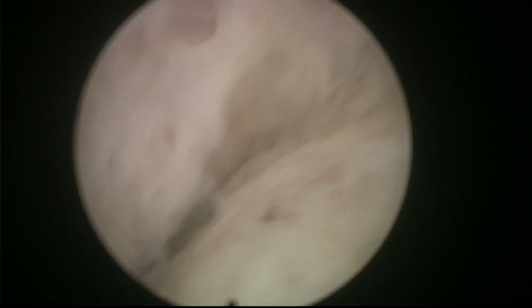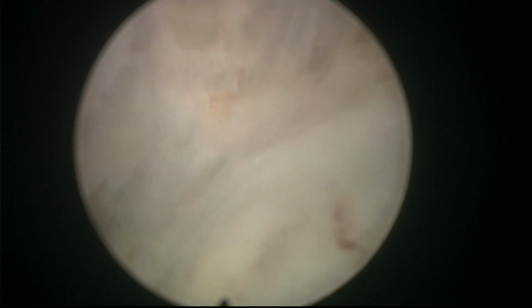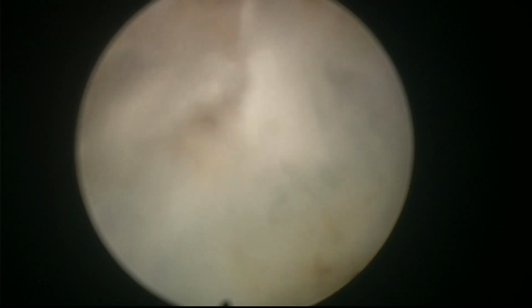But he was telling me, I managed to do a very, very large gland in an obese patient without having to do a perineal urethrostomy. And I think that might be another advantage of the en bloc approach. So you see that you can possibly reach the bladder neck much better in patients with very large glands, because you don't have to get over the middle lobe to enter the bladder.